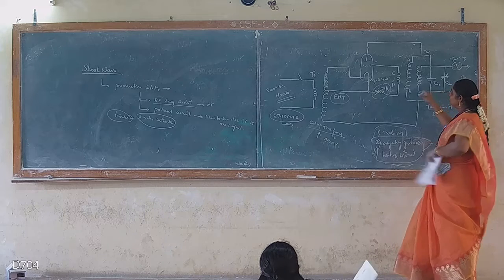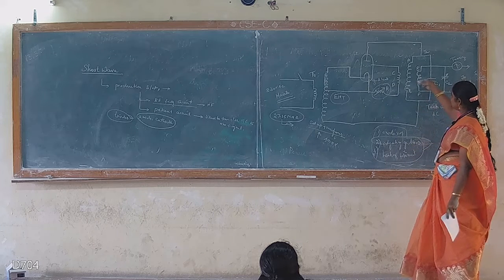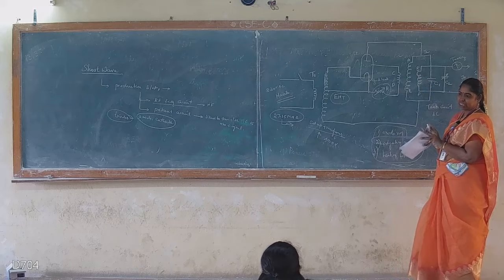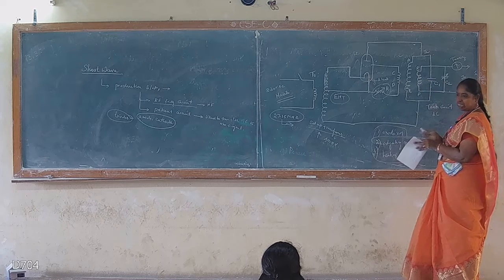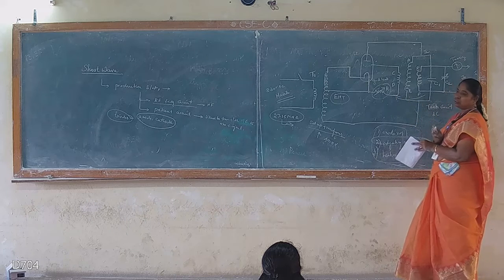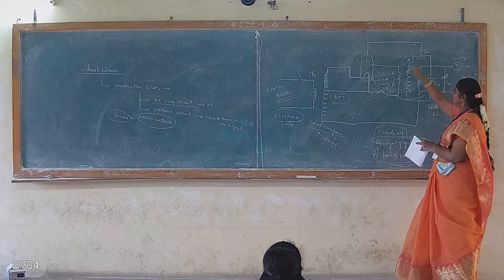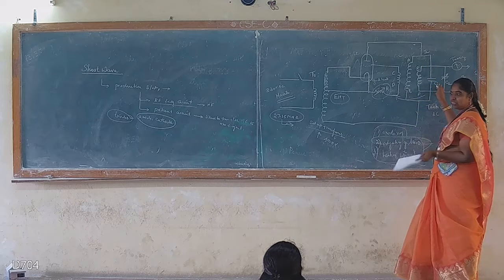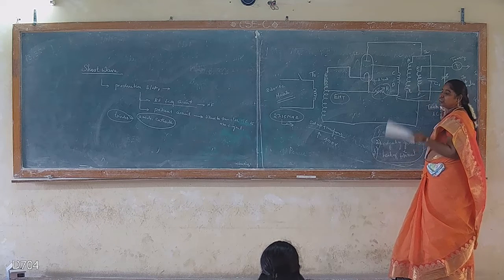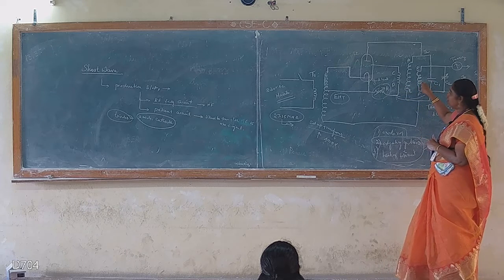Now, what is the purpose of EF? EF and CD here together form a transformer, which means there will be a transformer-induced EMF. So what will happen is that it provides feedback to the main circuit. Here the LC circuit forms an oscillator, and an oscillator consists of feedback. The type of feedback here is positive feedback. In order to provide the positive feedback, this CD and EF are formed.